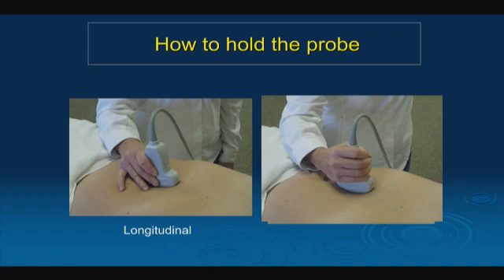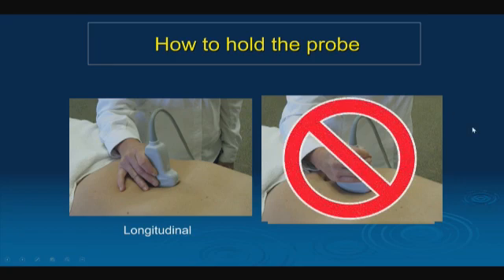They're so afraid of moving that they just hold it so tight. That doesn't do you any good either. You got to be relaxed, got to be able to move the transducer around freely and still maintain control. So you don't want to do either of those.